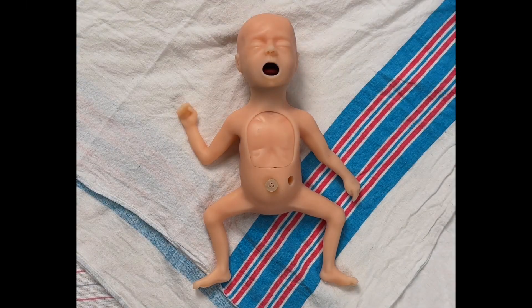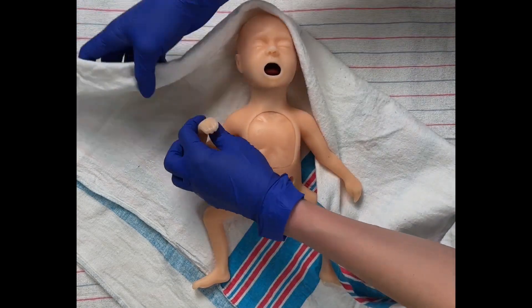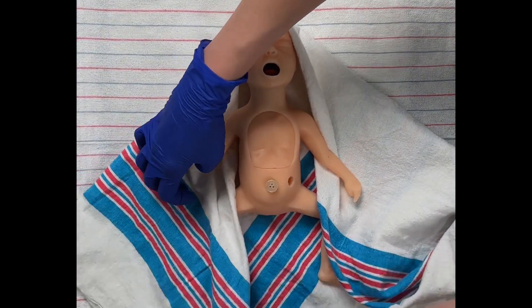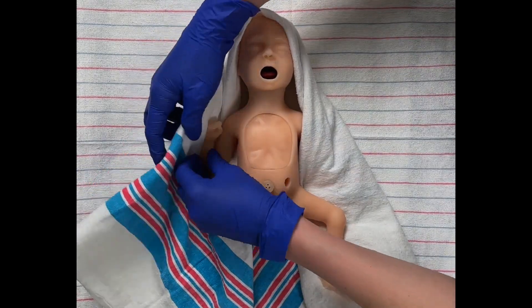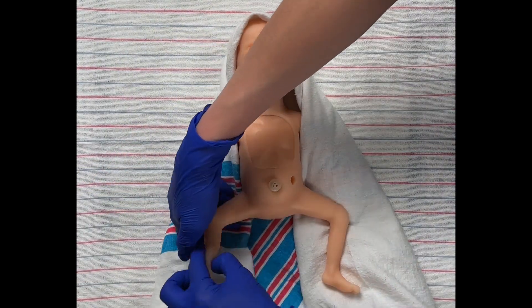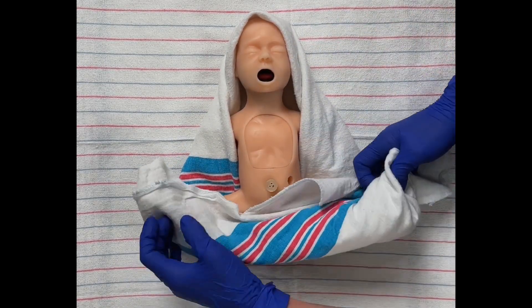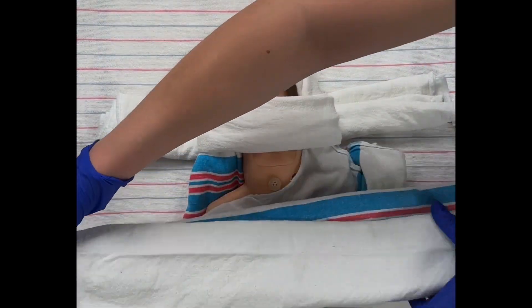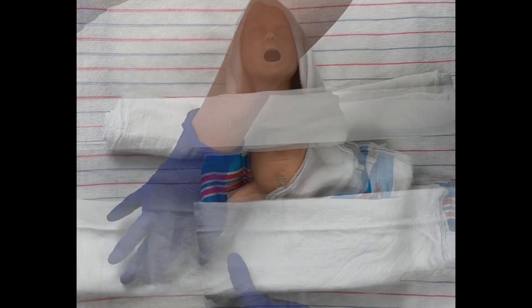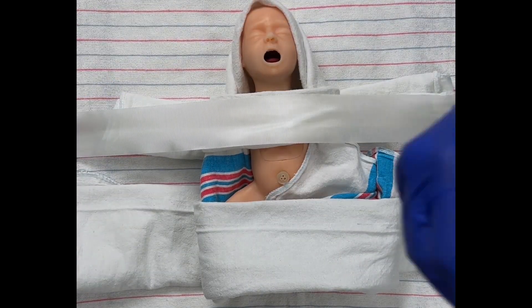Place the infant supine and secure limbs with blankets and tape. Position the baby on a triangular-shaped baby blanket. Cover the baby's head, then tuck the baby blanket under the shoulders. Roll the blanket around the arms, then tuck the end of the blanket under the baby's legs and buttocks. Roll the blanket around the baby's legs. Wrap small white cloths around the arms and legs. Place silk tape over the small cloths, then secure onto a radiant warmer.